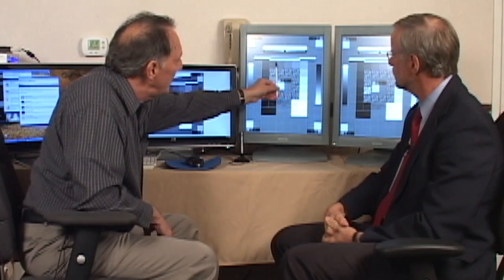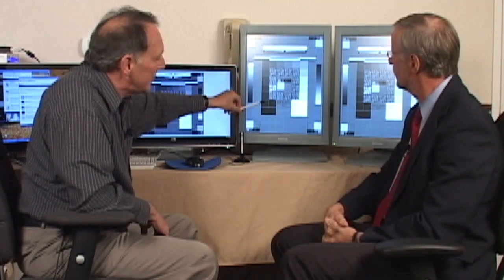And what you'll find out a lot of times with displays, they may be very well calibrated at the upper end. They may have a very good distribution of luminance responses, and they'll be weak in the midsection. You won't be able to see them up here too well, and then they may overemphasize it down here. So you're looking for balance, and the 5 and the 95 is one of the first starting points for balance.